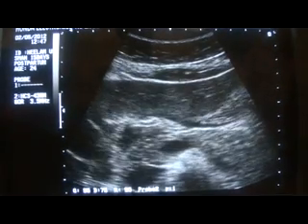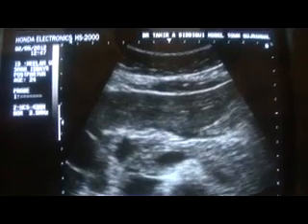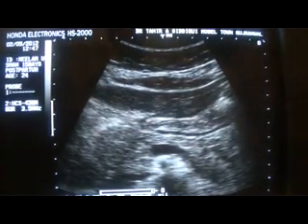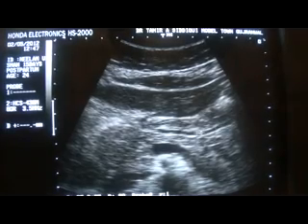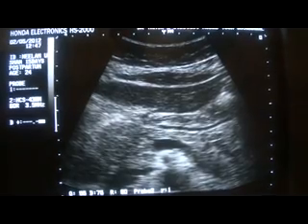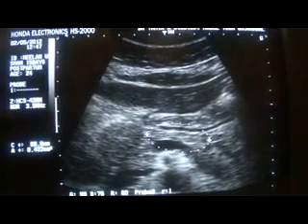This area represents the collapsed bowel — this is the bowel with its segment — and this area is the pancreas, specifically the body of the pancreas. Why is it the pancreas? Because this vessel that you are seeing posterior to the body of the pancreas is the splenic vein. The splenic vein is taken as the landmark for the identification of the pancreas. This is the superior mesenteric artery in transverse section, this is the aorta, and this is the IVC. Now this structure, if you see, is a bowel wall and not a vessel.